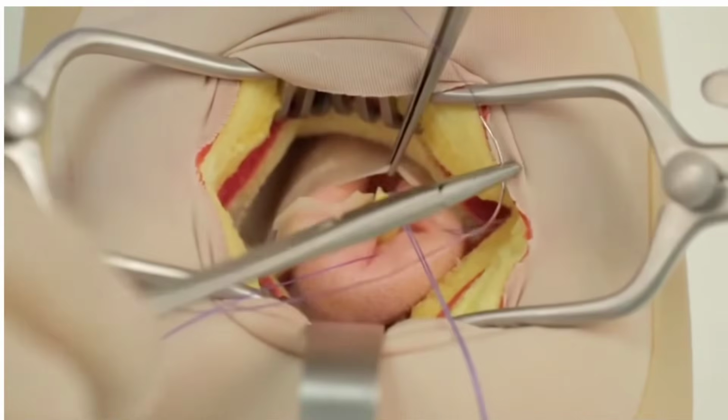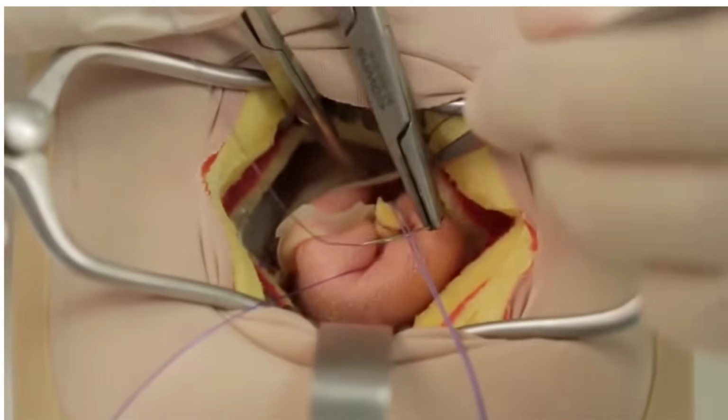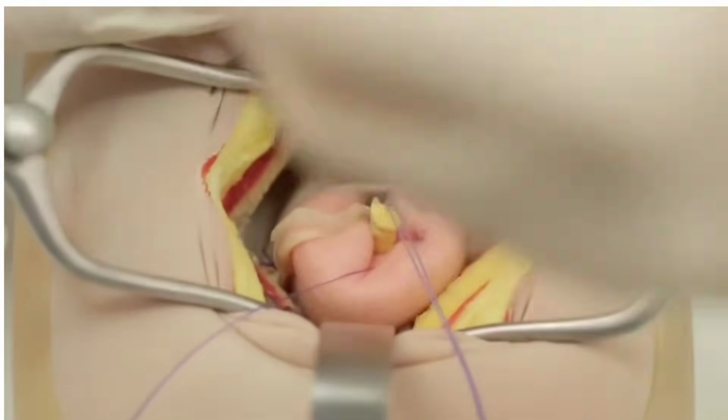Inspect the stump for bleeding or leakage. Irrigate the operative field with warm saline. Suction thoroughly. Remove the protective packs and check for hemostasis.